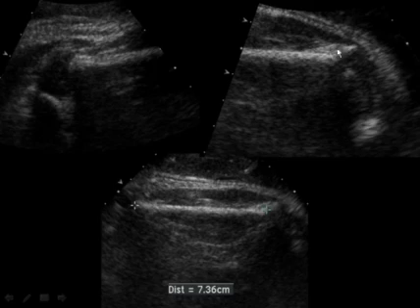The measurement should be marked right at this end. And then at the far end of the femur, here's that distal femoral point and the epiphysis with a little bit of ossification in the center, and this is where the cursor belongs, at this end of the femur. And this gives us a more accurate femur measurement when these landmarks are used, of 74 millimeters.